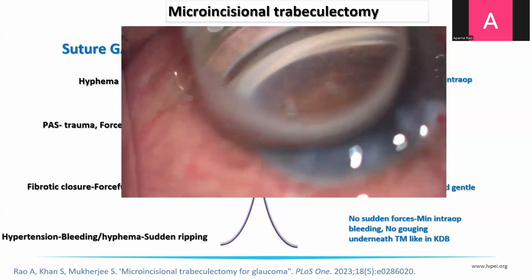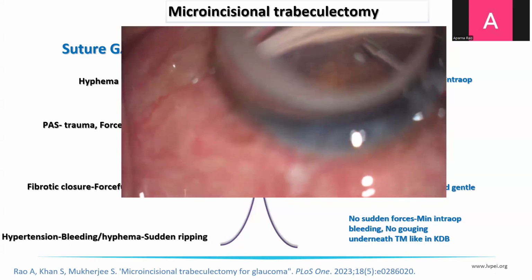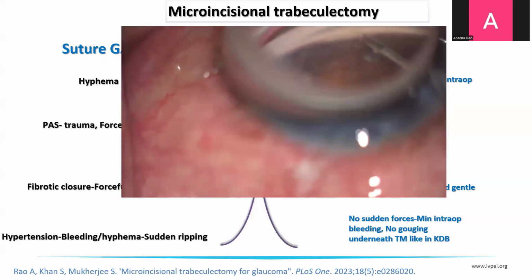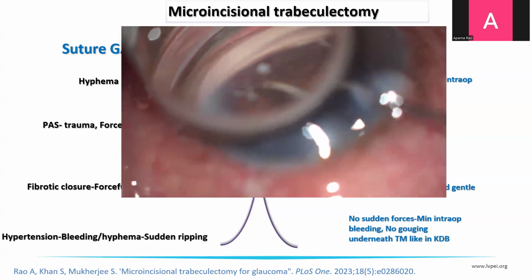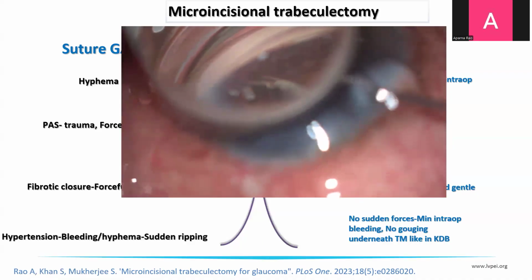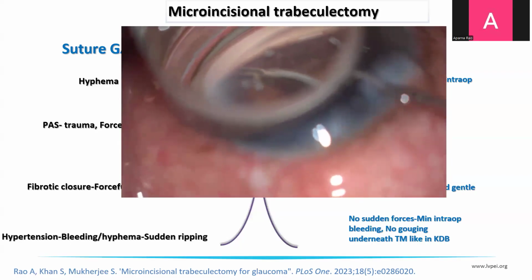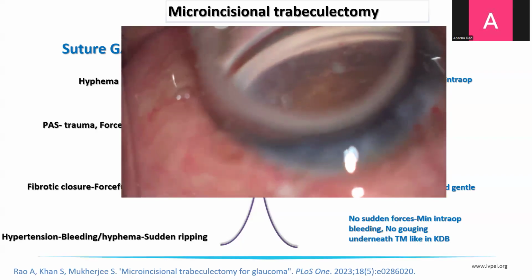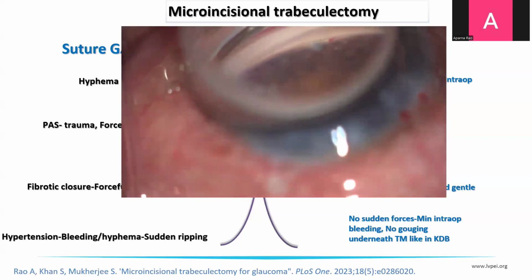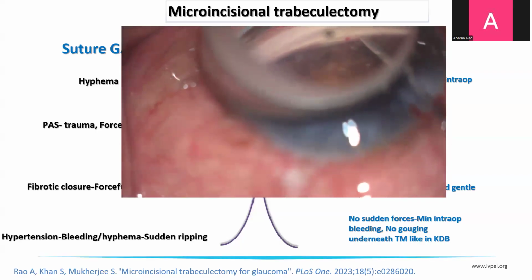This step is now followed by two vertical cuts on the edges of the delineated region, as seen here using a 25 gauge micro scissors straight angle. This ensures that the strip that we have delineated by these two vertical cuts, when stripped away, does not extend to the adjacent regions.